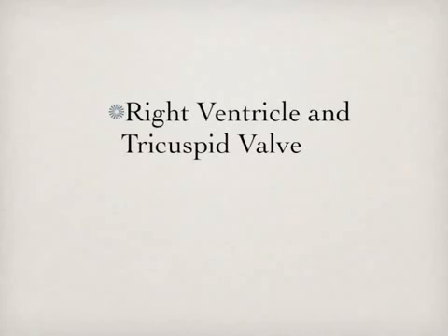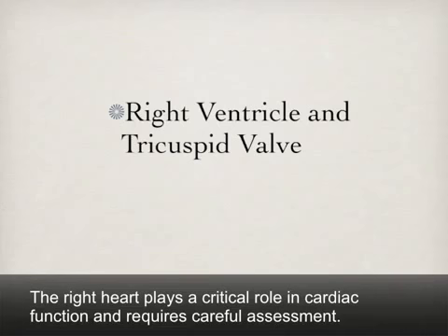This session will focus on assessment of the right ventricle. While the left ventricle tends to be the focus of exams, the right heart plays a critical role in cardiac function and requires careful assessment.